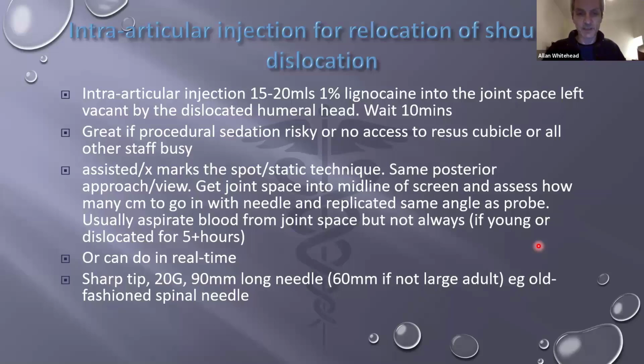So it's still using the same technique as we've seen with visualizing the dislocated shoulder, and with visualizing an effusion. It's a posterior approach. And I will demonstrate after I get past this slide.